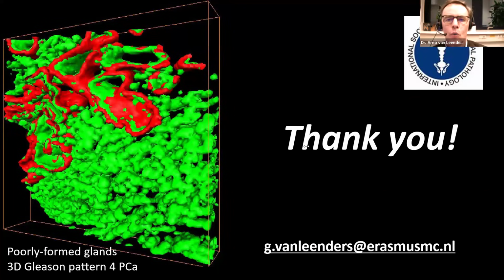The problem is it's not always that easy to distinguish IDC from invasive cribriform. The absence of basal cells doesn't prove that you're looking at invasive cancer, it could also be IDC. So I know many people ask this: should we distinguish then in reporting? At this moment, we do not have to distinguish that.